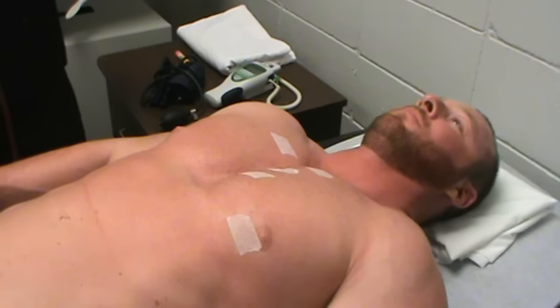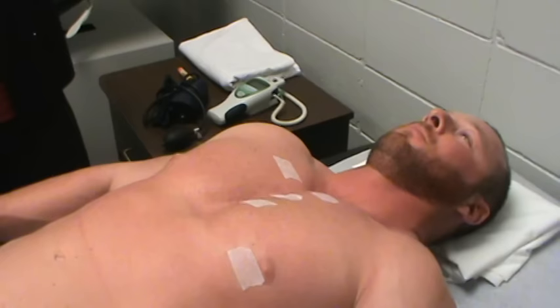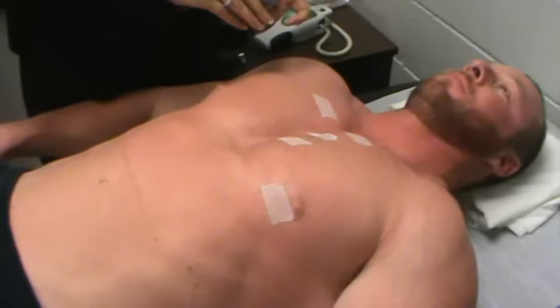No heart problems or anything like that, Brian? No. No hypertension, anything like that? No. Okay. Okay, just relax. I'm just going to listen.